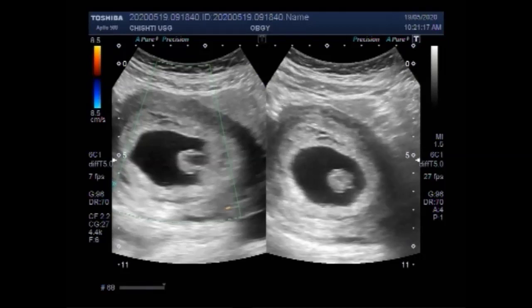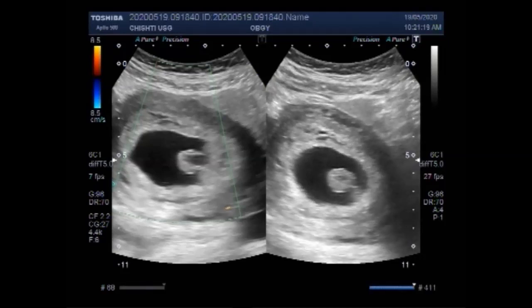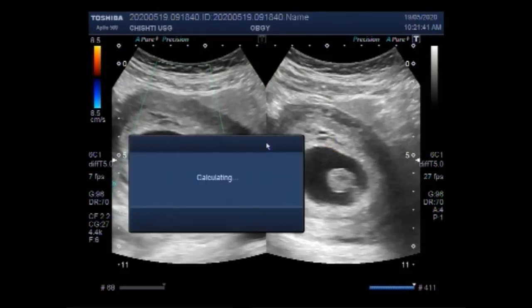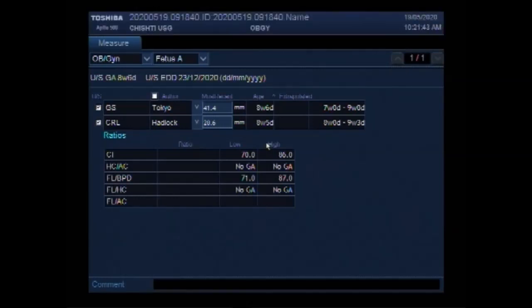The umbilical cord forms by the fifth week of development, replacing the yolk sac as the source of nutrients for the embryo. The umbilical cord connects the developing baby to the mother in utero. It attaches to the baby at the abdomen and to the mother at the placenta. The cord forms during the fifth week of gestation, which is the seventh week of pregnancy.